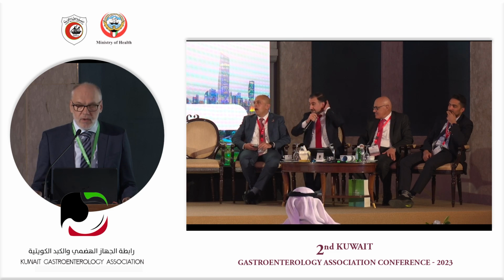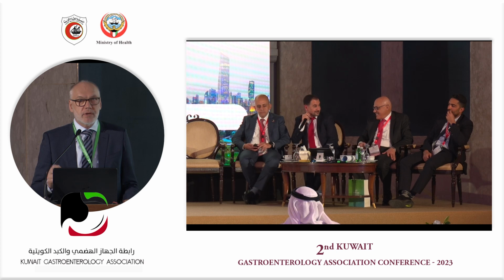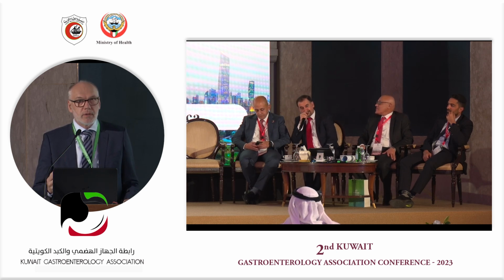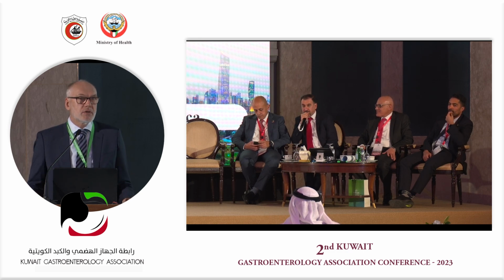No, you have a high pressure and you have an inflammation. And if you have an inflammation, you can stitch, you can clip, you can do whatever you want. It will always open because you have an inflammation, and additionally you have high pressure. Therefore, if you try to close it, it will be closed for 1 or 2 days, and then it will open again.